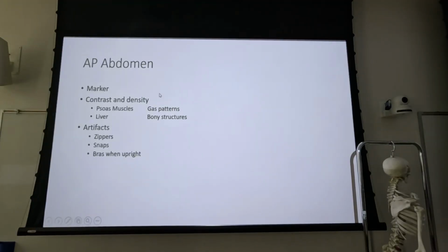If it's a decubitus, then generally speaking, if I can see the light, I'm going to put it in the light. If I can't see the light, then I'm going to put it in the soft tissue on the elevated side. But I'm going to try to be careful not to put it where it would obstruct any kind of free air. So outside of the anatomy of interest.